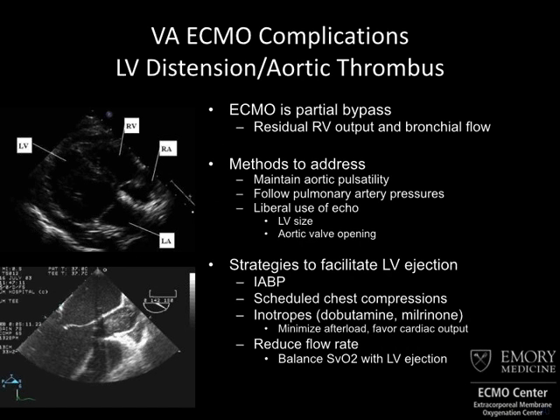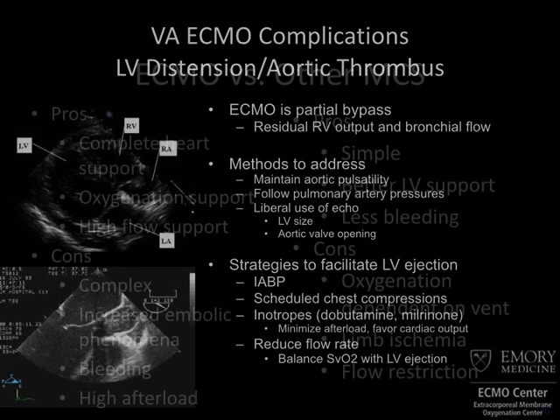The other thing that can occur with ECMO is LV clot formation. Because there's such high afterload from ECMO, you can wind up with a clot that forms. What you see in the bottom window here is someone's LVOT that's completely occluded with clot. And there's a variety of strategies to treat this, which includes intra-aortic balloon pumps or periodic chest compressions or putting an Impella device in there. There's lots of things that can be done.